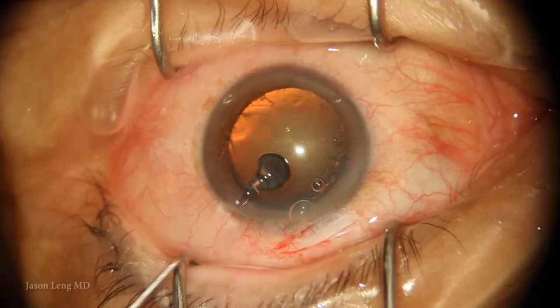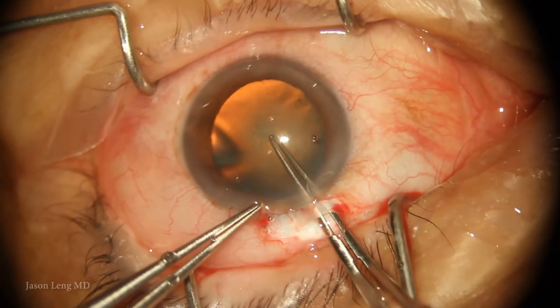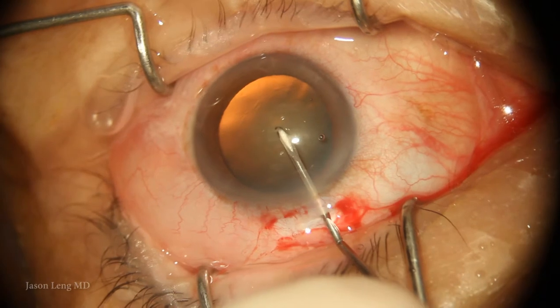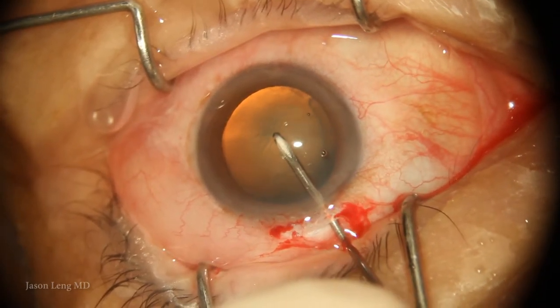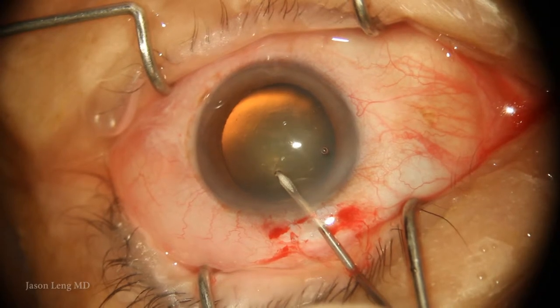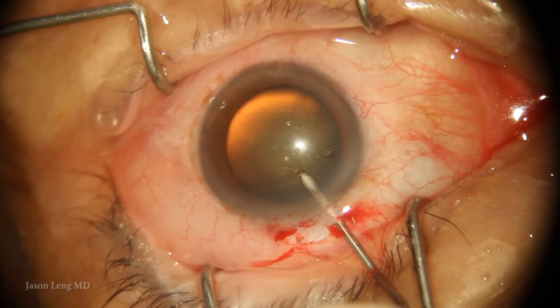Here I made my 3-millimeter superior mini scleral tunnel. I usually initiate my capsular rexis with the cystitome, but in this case there's just not enough zonular traction to be able to do that. Even with the cystitome needle, you can see the whole lens-bag complex moving around as I'm just trying to initiate my rexis.